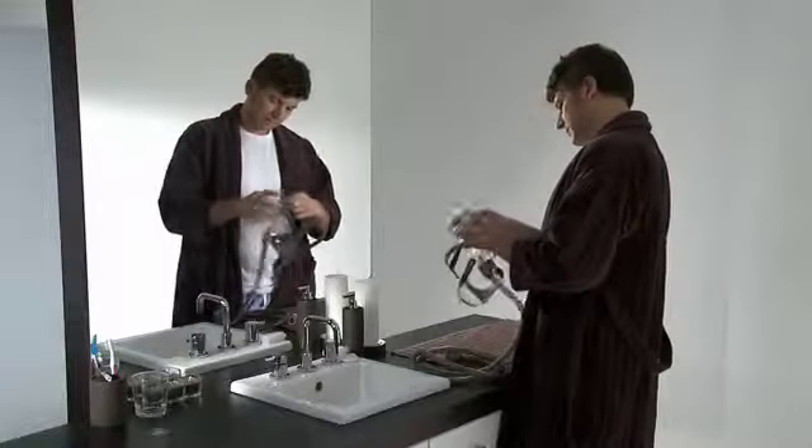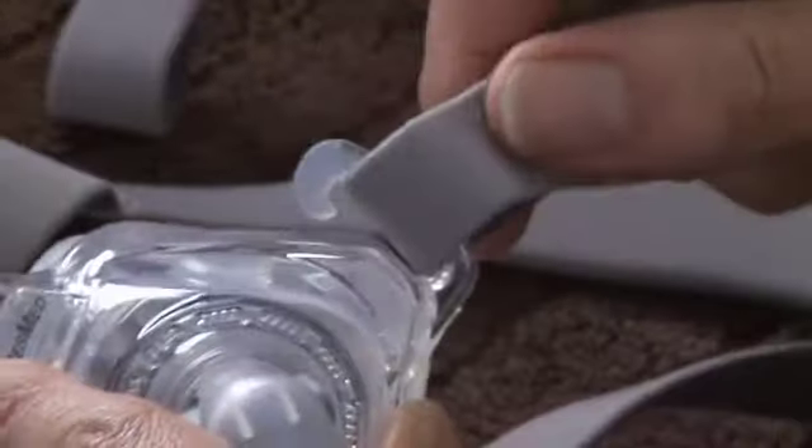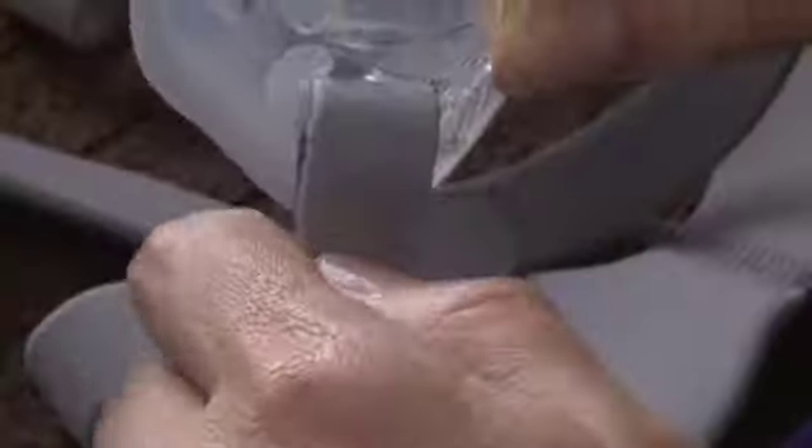Firstly, remove the headgear by unhooking the upper and lower headgear straps from the mask frame. There is no need to undo the Velcro.